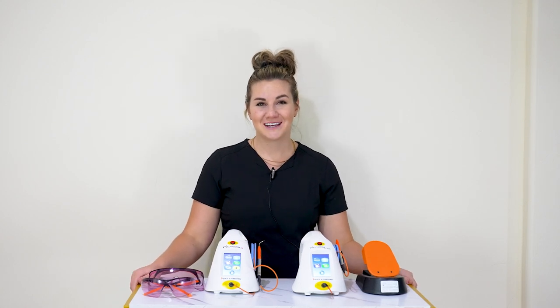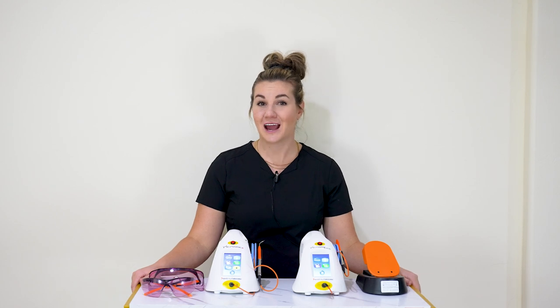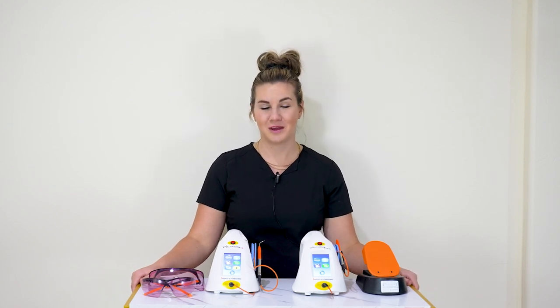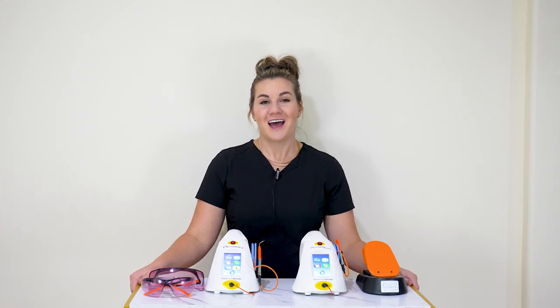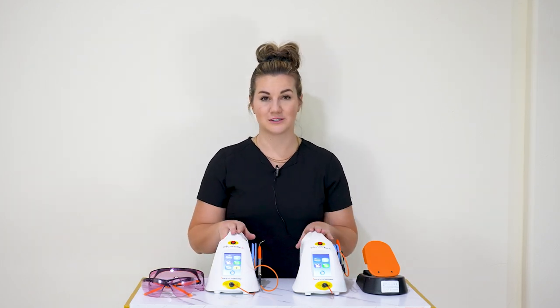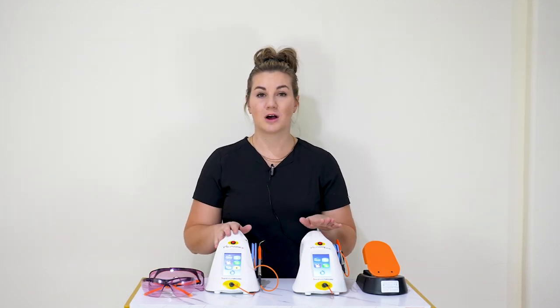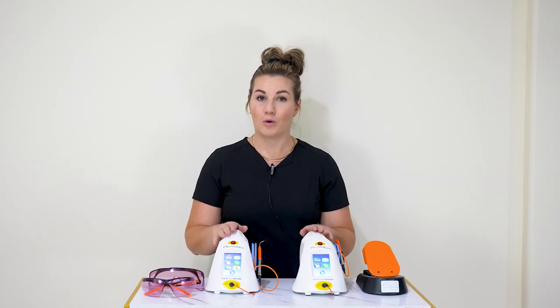Hey guys, it's Nikki from AMD. I'm going to go over how to implement your lasers into your office. At this point your laser should be set up — if not, please call our customer care reps and have them help you, or watch our YouTube videos to help you set up your laser. I have both of our Picasso lasers here: the Picasso Plus and the Picasso Lite. This demo will go over how to implement both of the lasers.